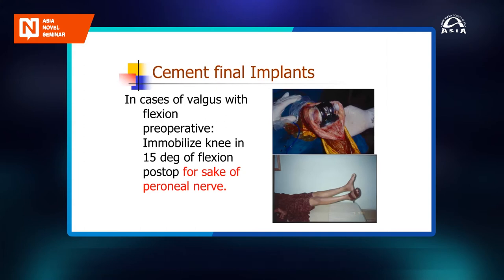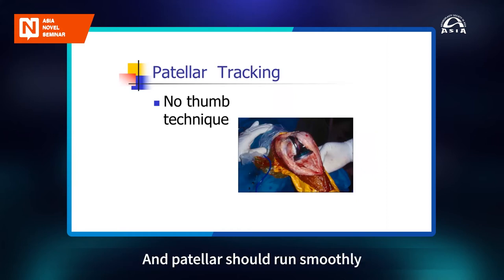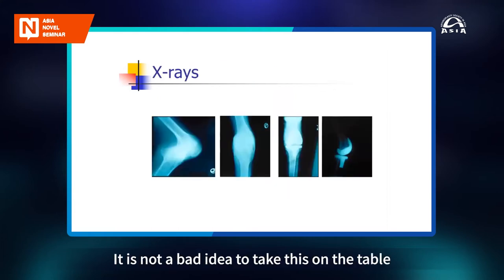Then you must check the patellar tracking, with the patella cemented with a no-thumb technique, which is a standard process. Flex and extend, and the patella should run smoothly. Again, it's very rare that you need to do a lateral patellar release. And of course, these are the x-rays. It's not a bad idea to take these on the table, but otherwise you can take them later.